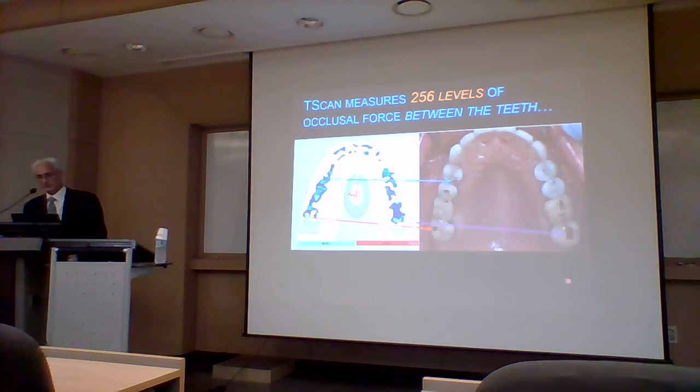But without the T-scan, in this case, we might treat this contact. We wouldn't treat this contact because we might think it was light force because there isn't a big mark. We might think this one is forceful, but it's actually very low force. And you can see how confusing that would be to you on a daily basis. 그러면 같은 사이즈니까 어떻게 고를지는 알 수가 없는 거죠.